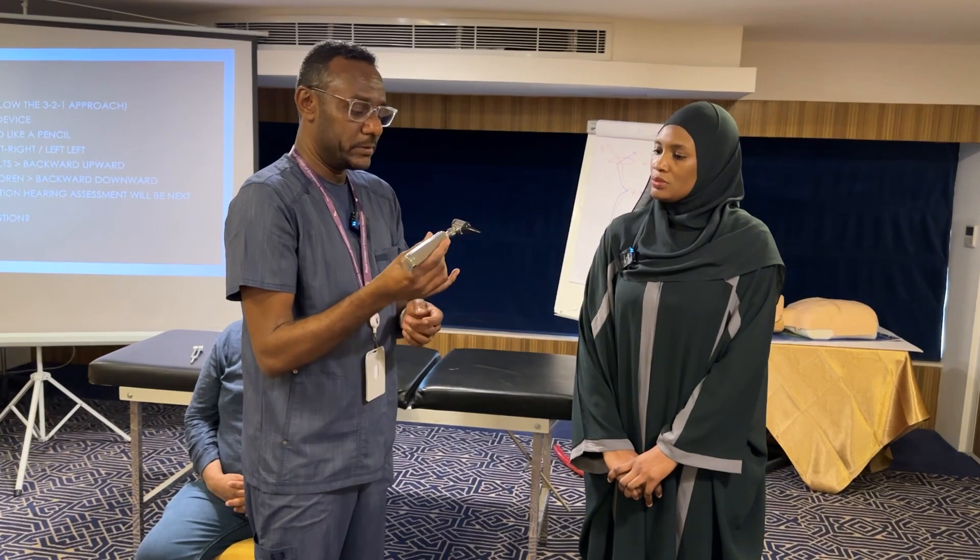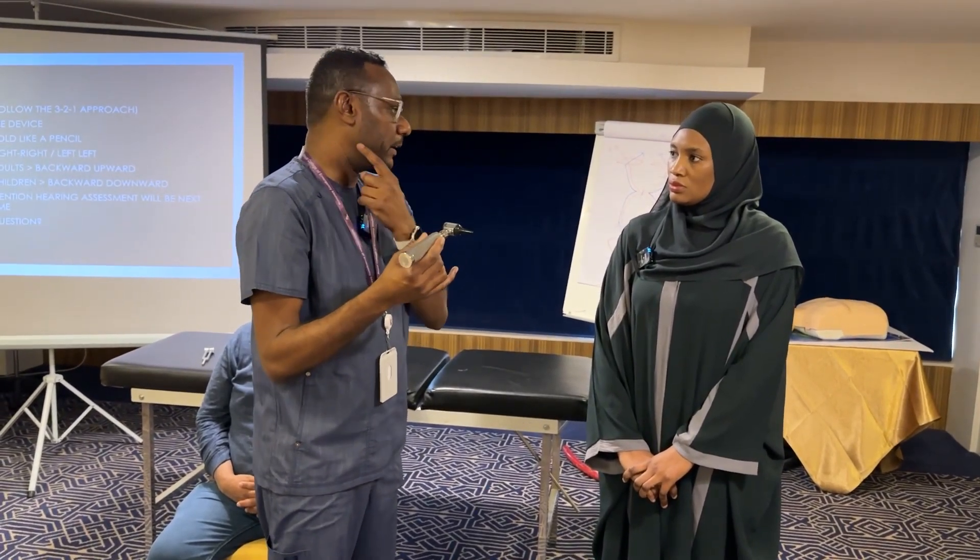We need to stabilize the edge of the little finger on the cheek of the patient. And then, if you would like to assess the right ear, we should start assessing the normal ear first, and then go to the painful one. If you would like to assess the right ear, then use your right hand. If you would like to examine the left ear, then you will use your left hand.